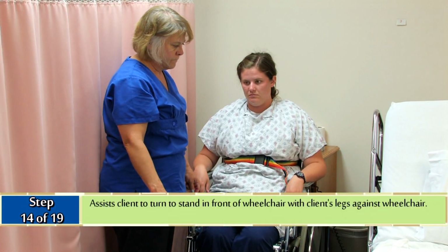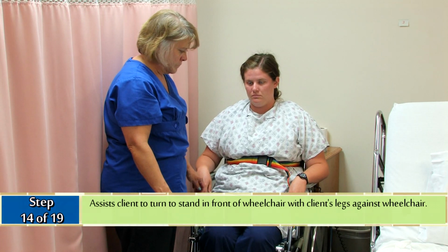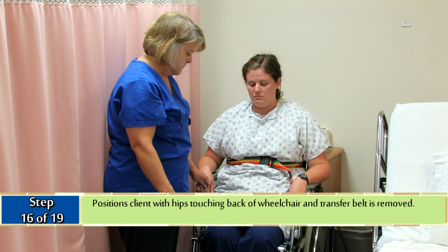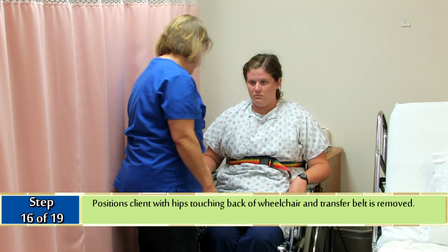Assist the client to turn and stand in front of the wheelchair with the back of the client's legs against the wheelchair. Lowers the client into the wheelchair. Positions client with hips touching the back of the wheelchair and the transfer belt is removed.